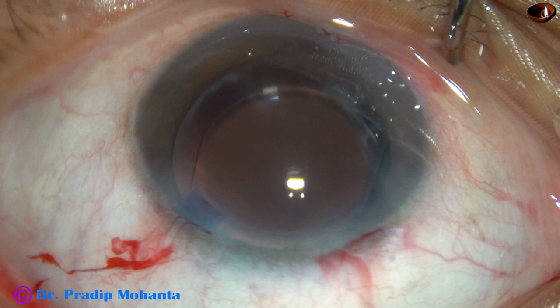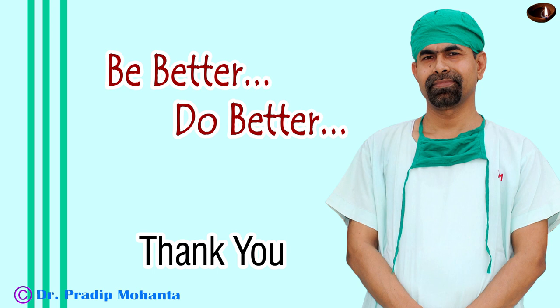Integrity of all wounds is checked with a cotton-tipped Johnstone bar — there should not be any leakage. A few drops of moxifloxacin are applied and the case is concluded. Thank you very much for your attention. Hope this video will help you develop your surgical skills. Be a great surgeon — serve your patients with love, respect, empathy, and great surgical competence. Surgery is a combination of science and art; put your heart 100% into surgery.